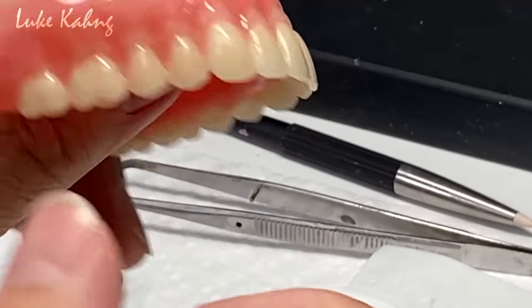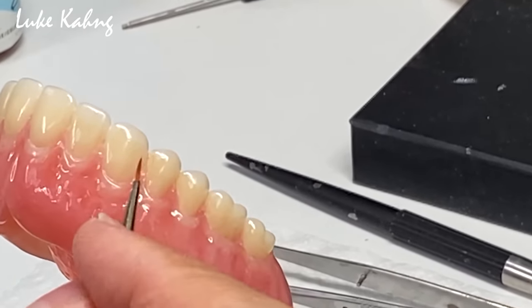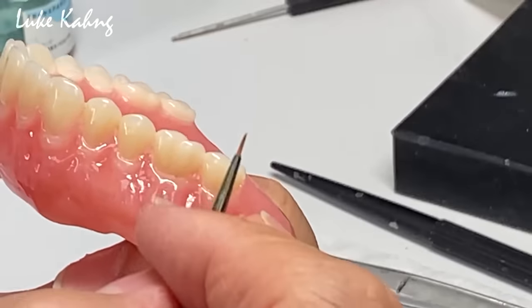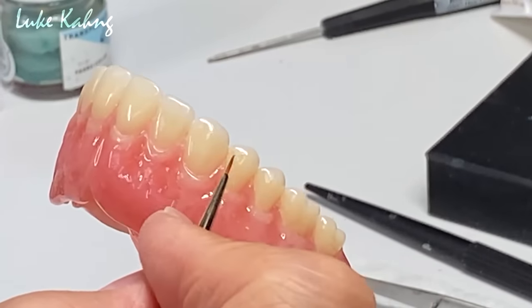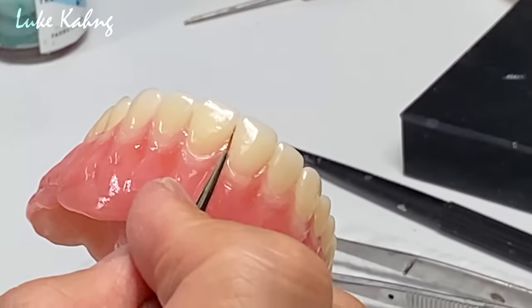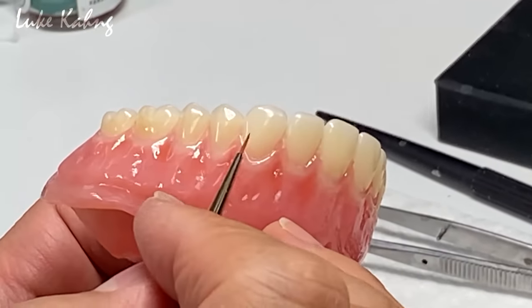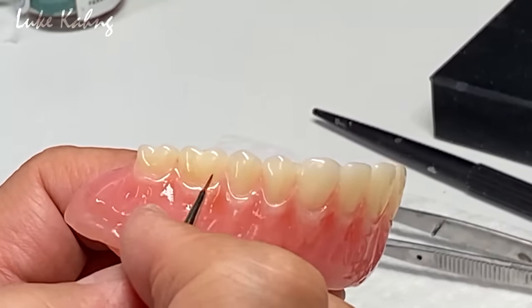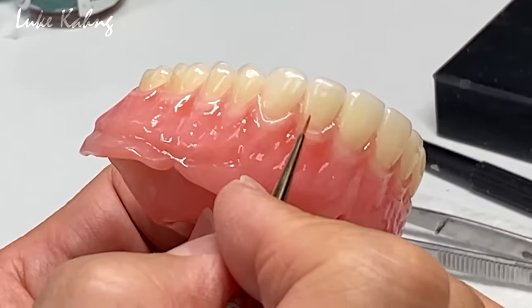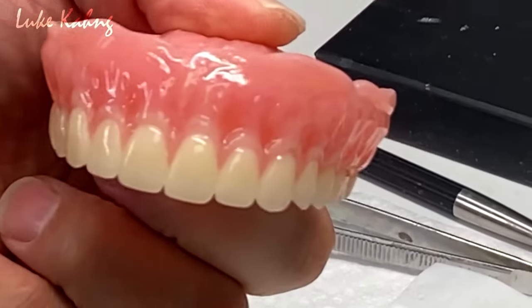Perfect. Okay, now let's put it in between the teeth, very subtle. A little bit. Okay. This is good. So now we can cure it.